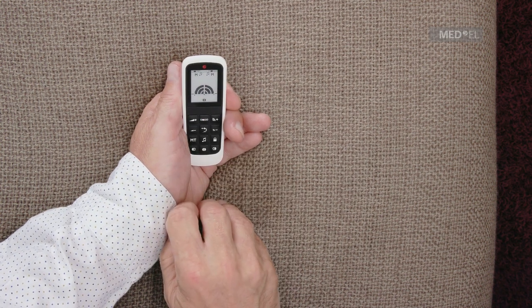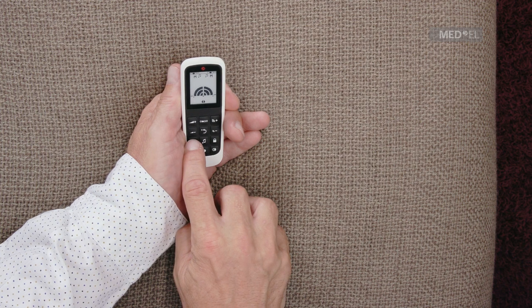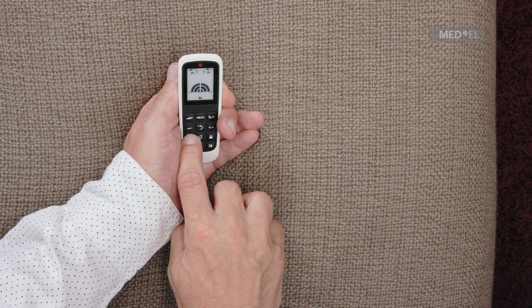To switch between hearing sound from your microphones, telecoil, or microphones and telecoil, press the MT button. To mute your microphones, press and hold the MT button for three seconds until the mute symbol is displayed.